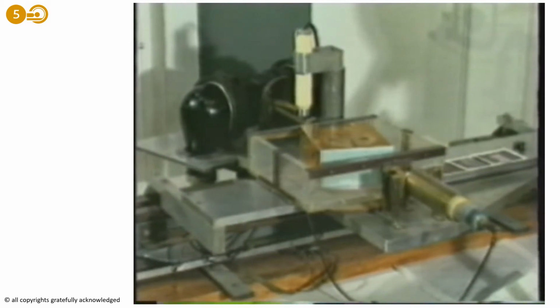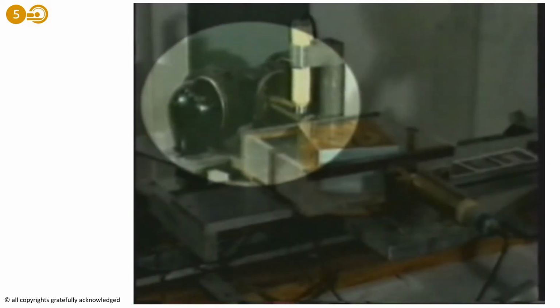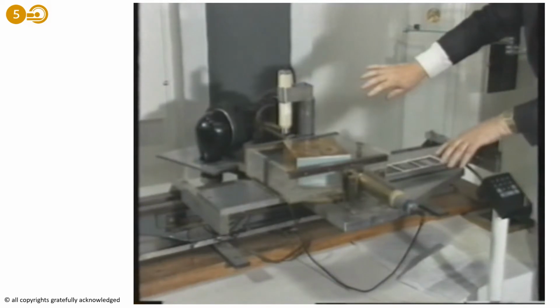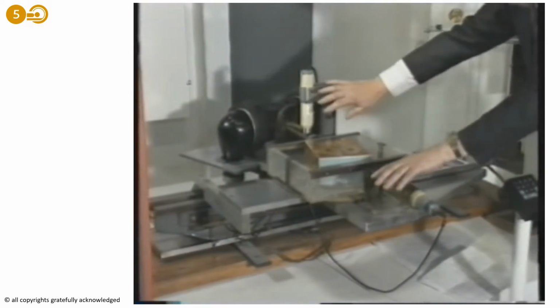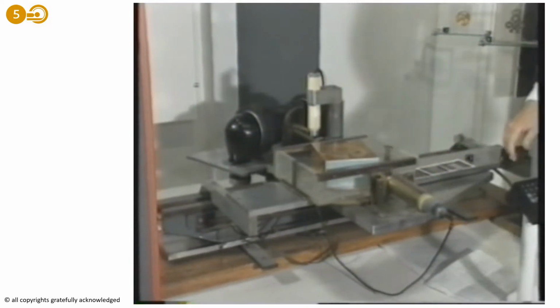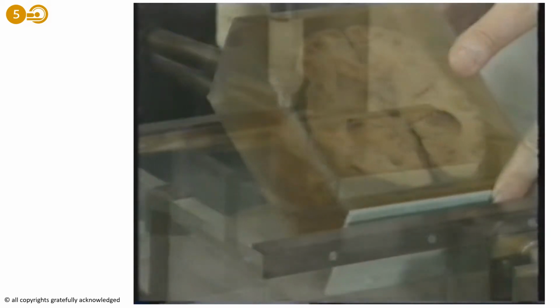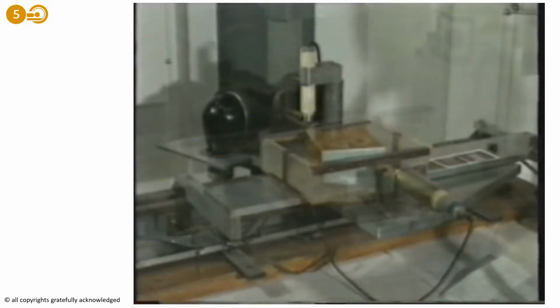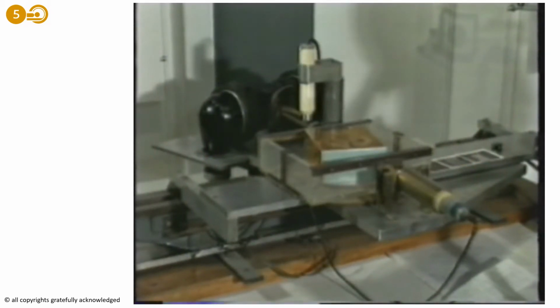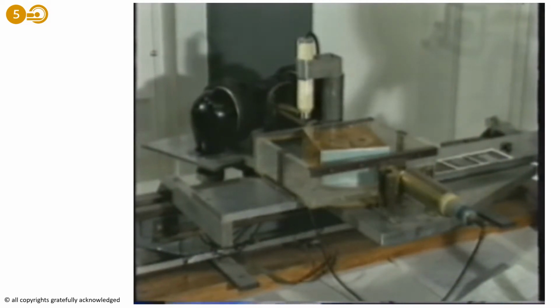The early tests used a radioactive source, but later this X-ray tube was used to speed up the process. The X-ray tube and detector scanned backwards and forwards while the collimated beam was passing through the object to be scanned. In this case, it was a pickled brain in a box. At the end of each stroke, the object was rotated through 1 degree. This process then went on for 180 degrees, and it took about 6 hours to complete a picture.